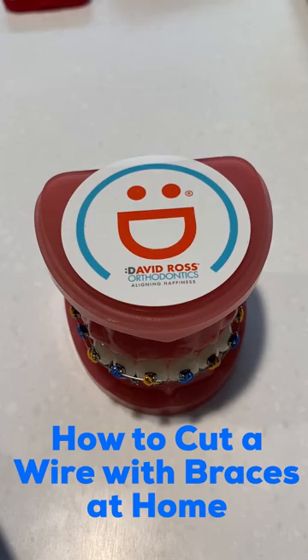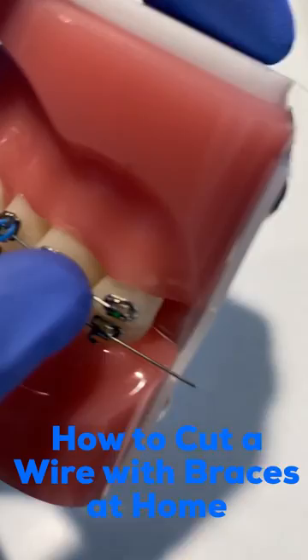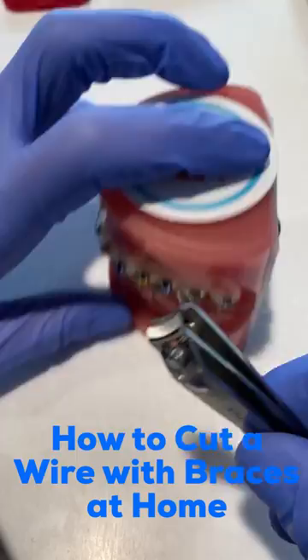You'd want to clean it with rubbing alcohol or soap and water so everything's nice and clean, and you're going to find that area that's bothering you. In this case it could be something sticking out the back that long, or it could be something that's in the middle sticking out or bothering you.